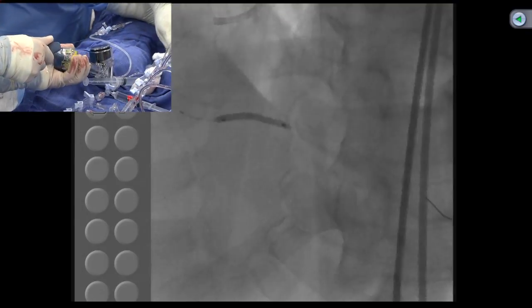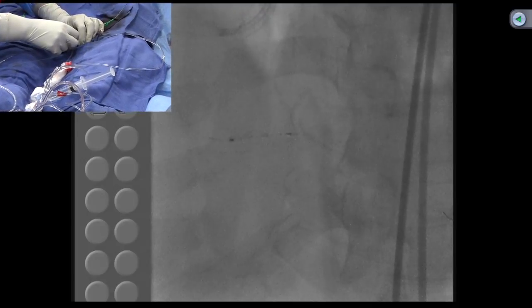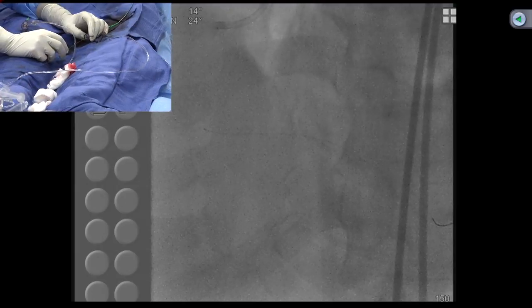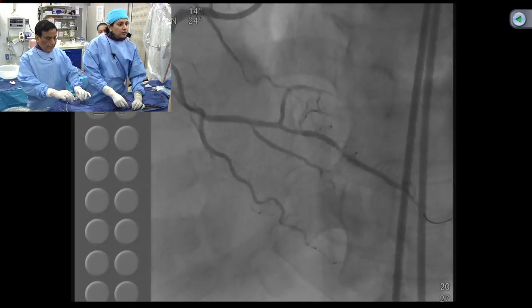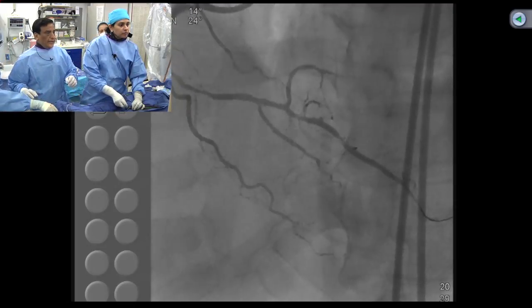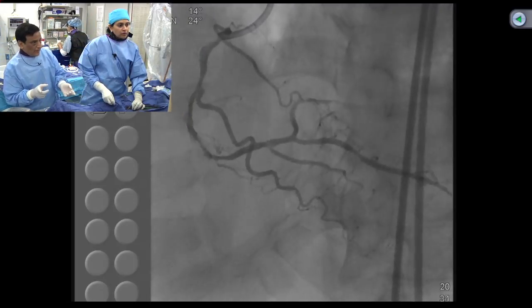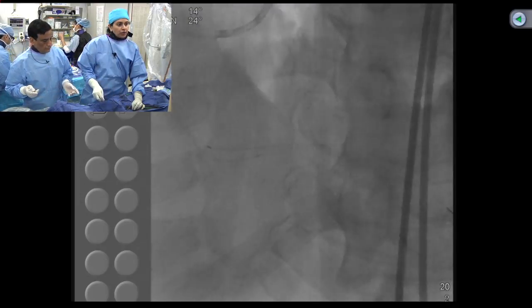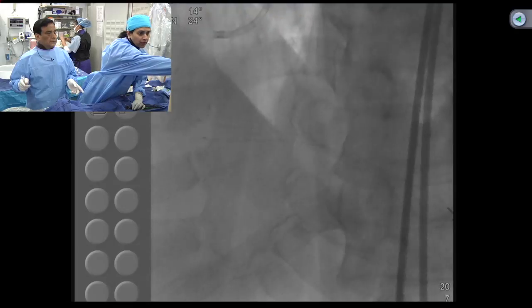Okay, down. Negative. I think you can come back in the guide and then make a stent strategy, because we don't need to worry about showing the entire vessel. It's just as long as we show the main area for CTO and the distal. Yeah, good. Nice. So clearly you need 2 stents, I would say. The area of one you have to put across. Maybe the question is, do you want to put one after the bifurcation and one at the angle and leave the rest of the area for the future? I would take a 2.75/28, or 30. 2.75/28 there.